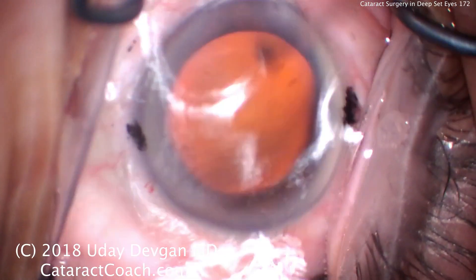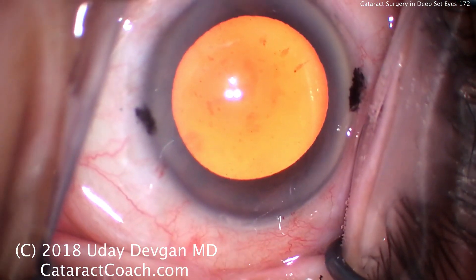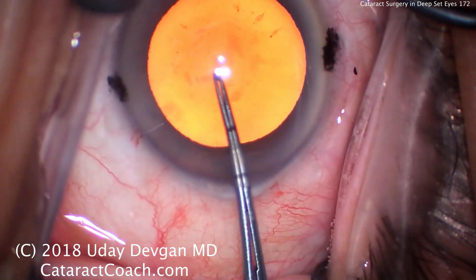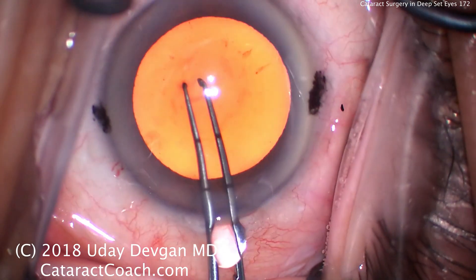We've edited this video. I'm going to show you just the beginning part here, show you the REX, and then we'll skip to the end for the key teaching points. This is not going to be a complete video start to finish of one case — it's going to be edited.